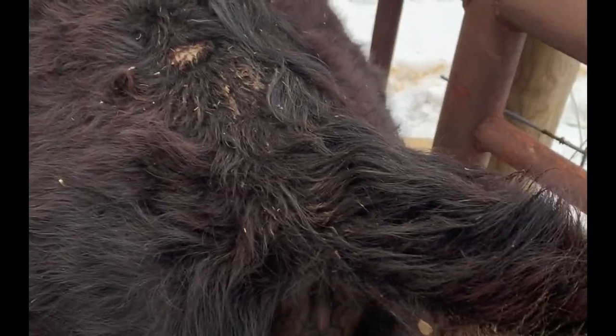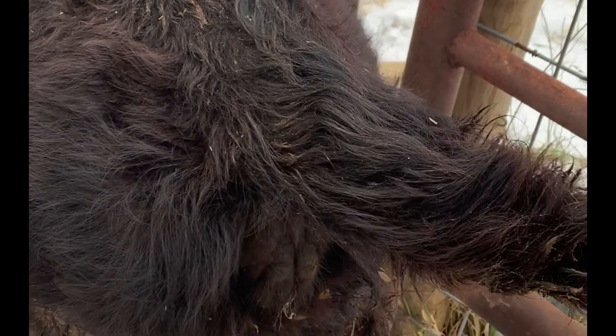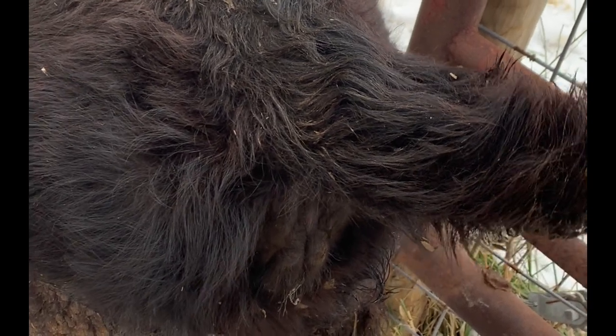Welcome back to GNF Legacy Farm. This is Kelsey, and today we are preg-checking a heifer. This heifer was AI'd about 45 days ago, so we're just going to do a cheap and simple blood test today and send it out to a lab to see if she's in fact bred.